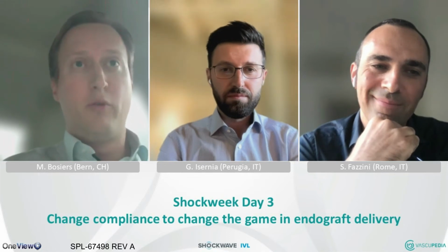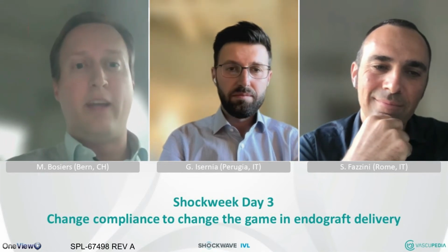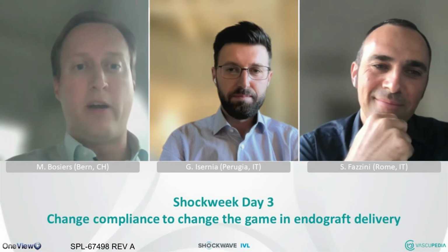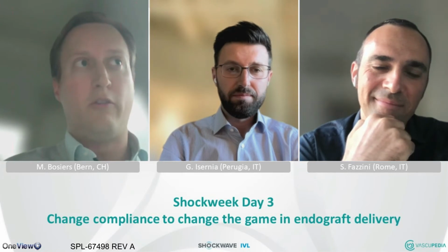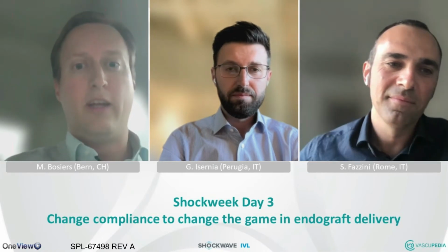So if I'm doing any kind of TEVAR, any kind of 18 French device, I will use the 8 millimeter IVL catheter. If, of course, as Stefano is using a lot, and he will show us later, a very low profile AAA endograft, 14 French device, I think 7 millimeter can be sufficient. Yeah, so I fully agree.